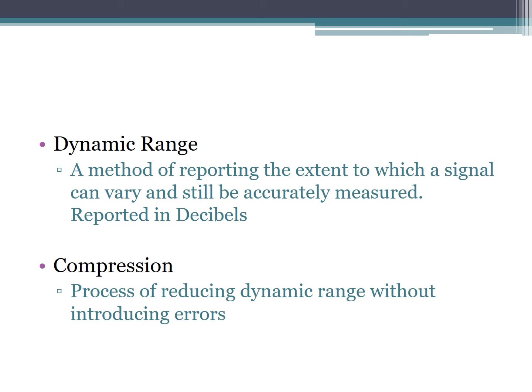As we move through ultrasound components getting down to the display, the dynamic range changes. It becomes less sensitive to those echoes. So we compensate for that with compression. Compression is the process of reducing the dynamic range without introducing any errors. This is an operator adjustable control of dynamic range. And it's going to assign weak amplitudes to the value of 0, and it may assign strong amplitudes to the strongest value, but all the reassigned echoes are still in the appropriate order.